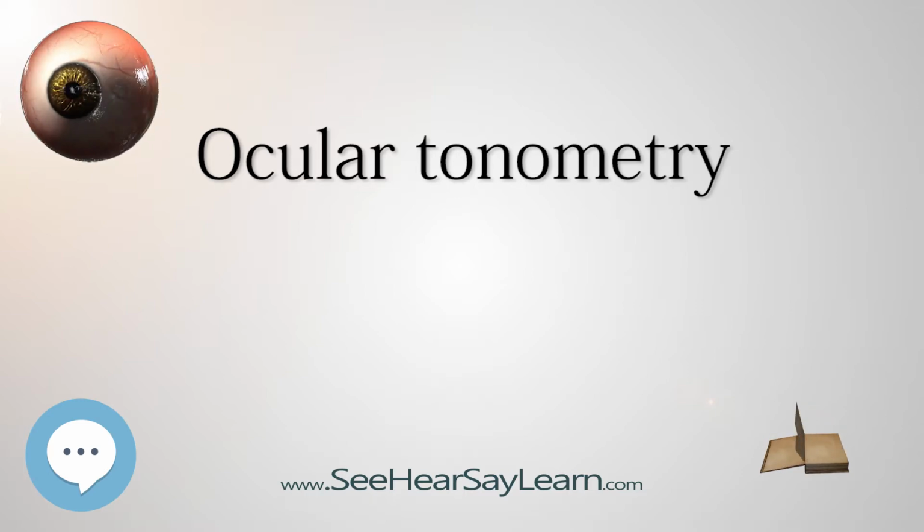Transpalpebral tonometry may be useful for measuring post-surgery IOP after myopic LASIK ablation because this technique is not influenced by the treatment. The Diaton tonometer still requires further evaluation and is not a substitute or alternative for more established methods. The Diaton tonometer has a large margin of error compared with commonly used tonometers, e.g., GAT, in most patients, including those with ocular hypertension, glaucoma, and glaucoma tube shunts.